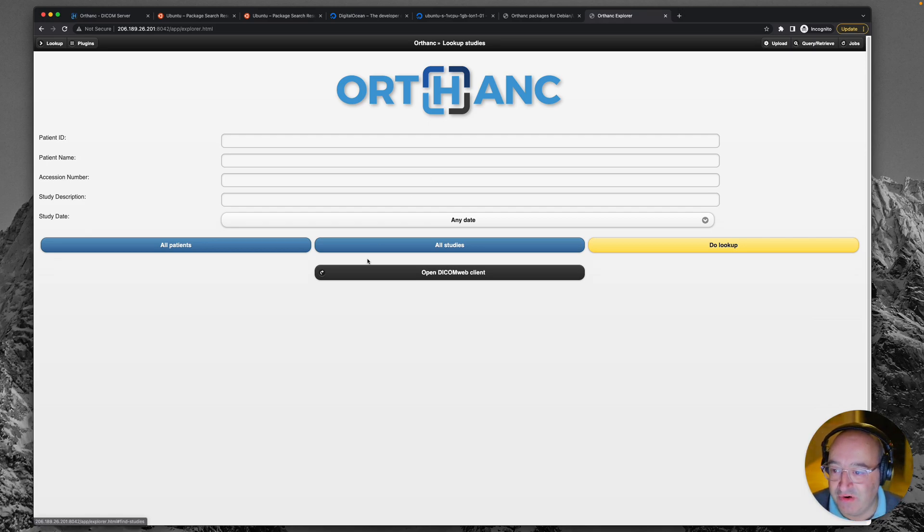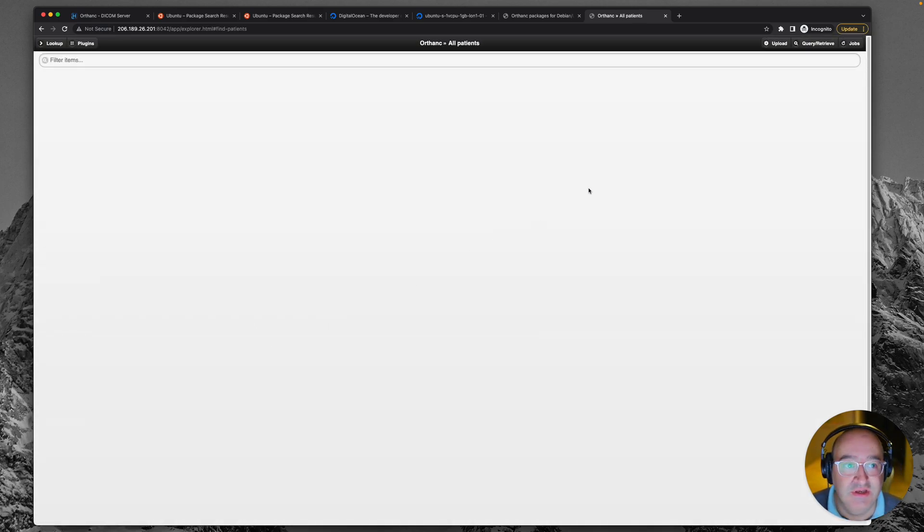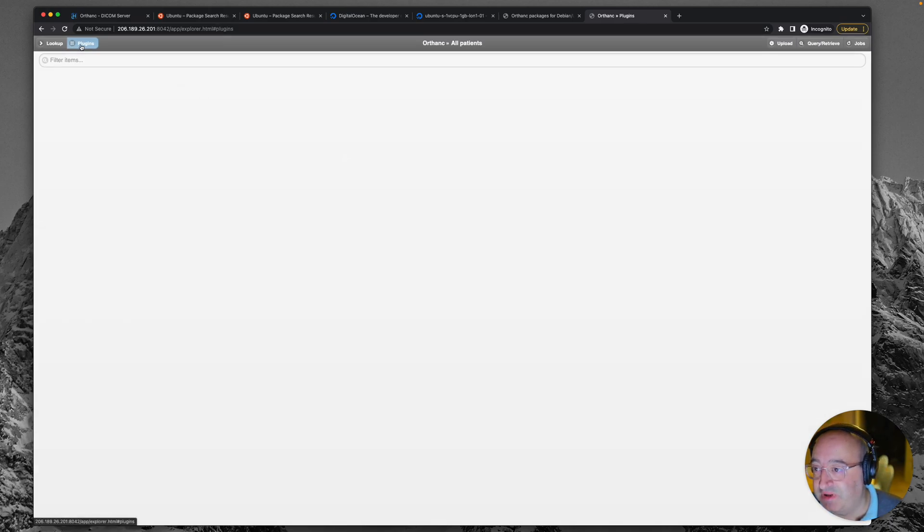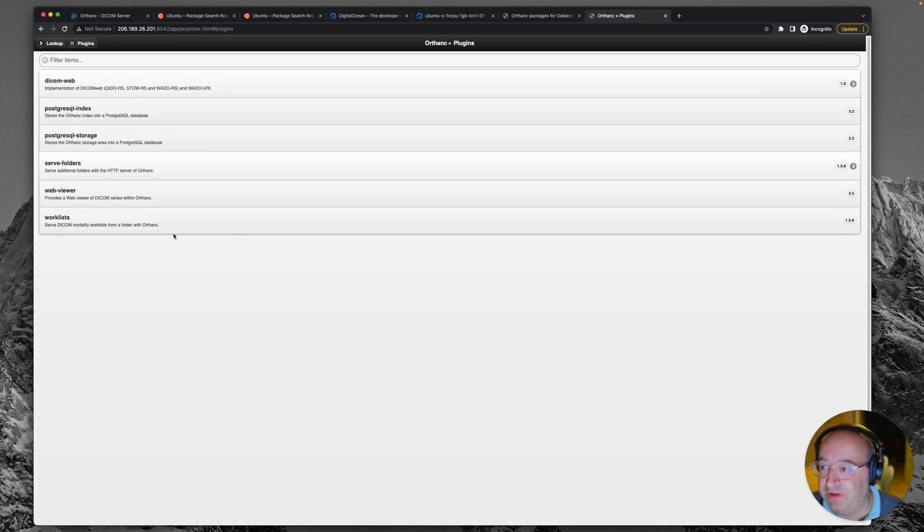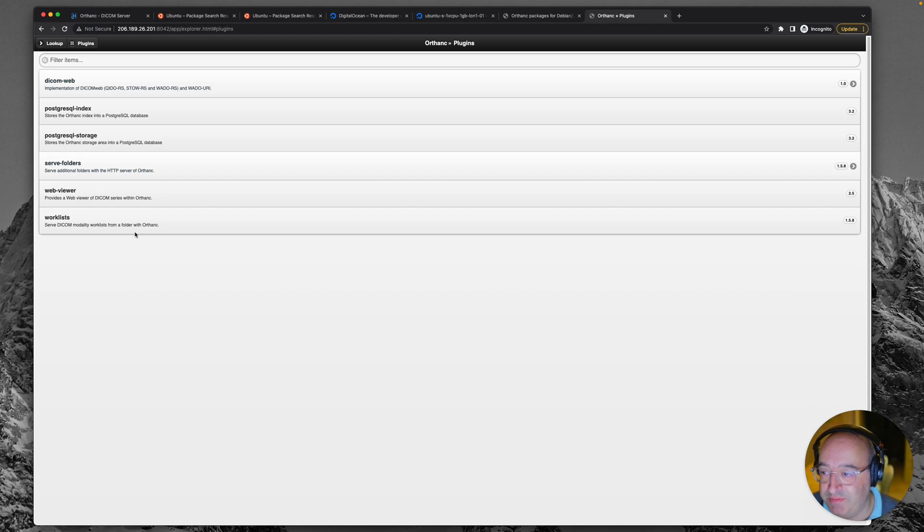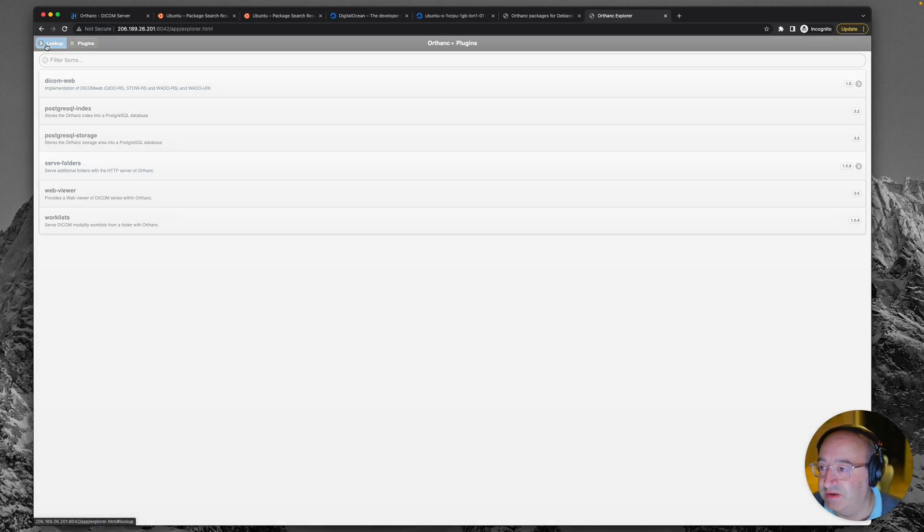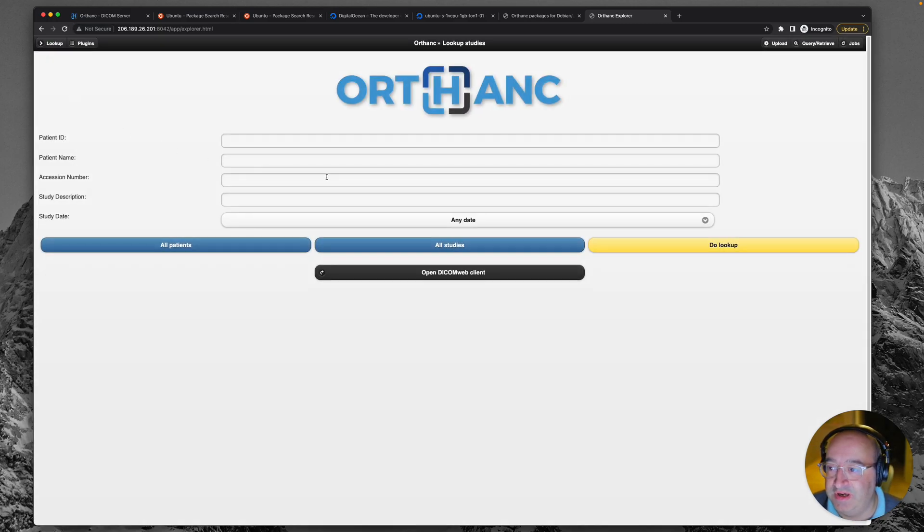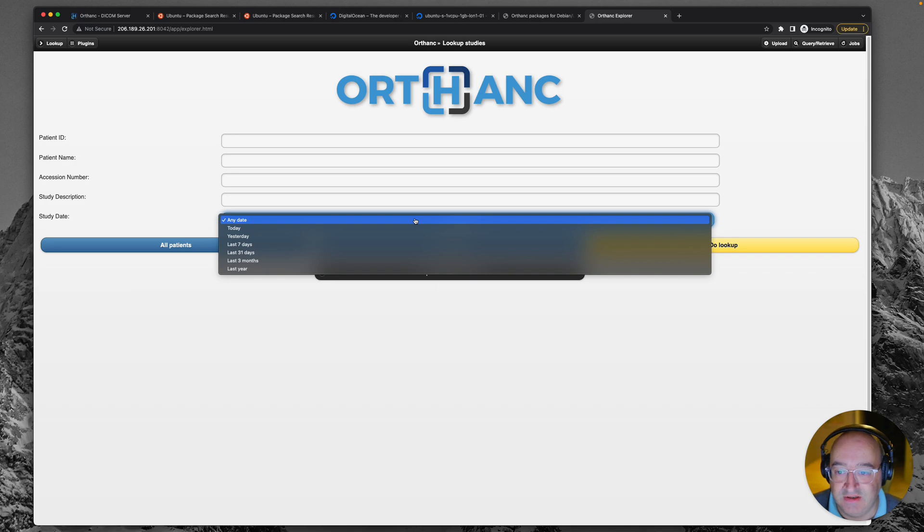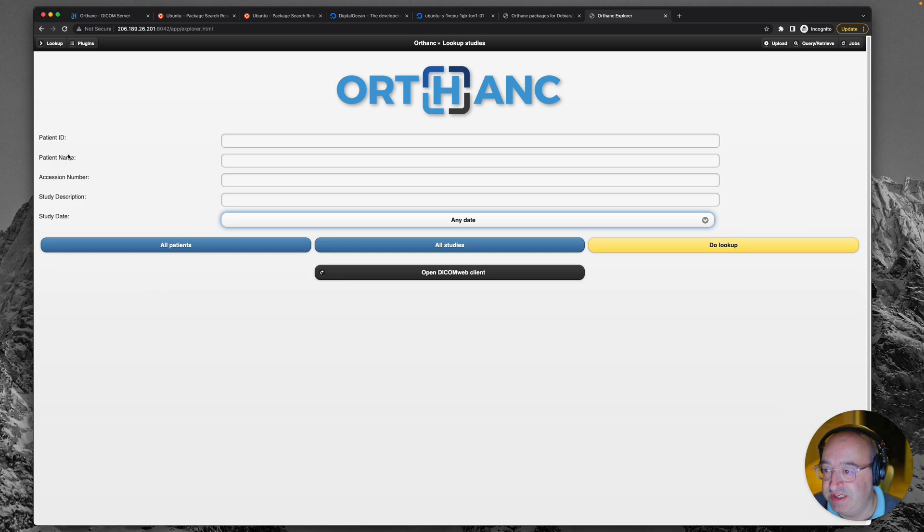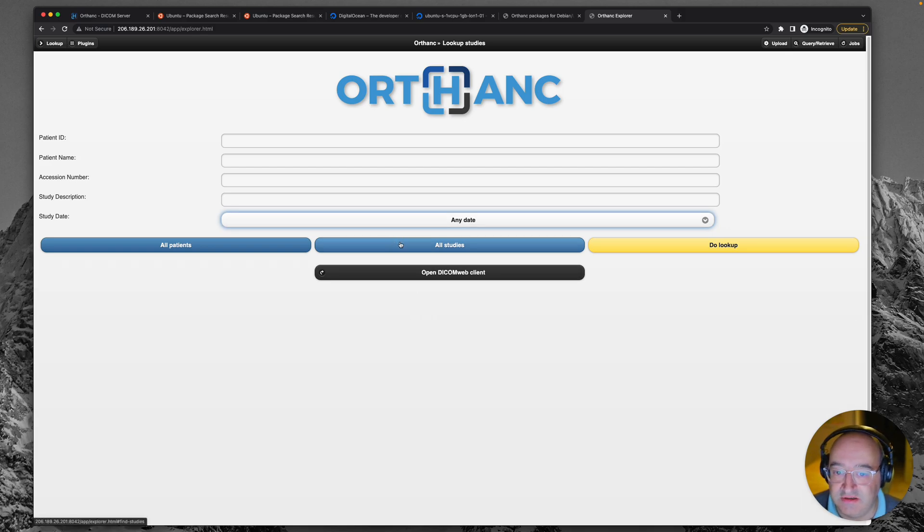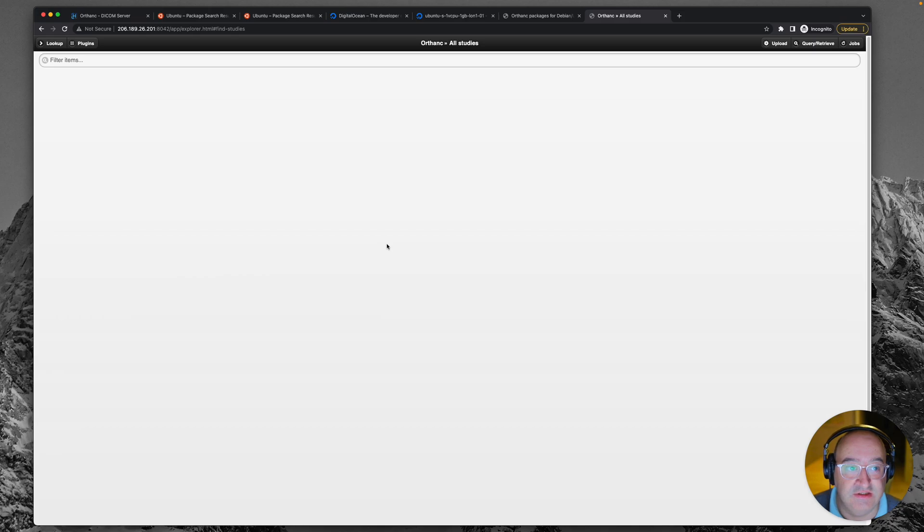So what can we do? We can have a look at all patients. And of course we've got none. We can see what plugins are installed. Now plugins are going to be those packages which you saw me installing when I did that long command where I pasted all the packages in. So you'll recognize some of those there. And we can click lookup and we get a search dialog. Yeah. Useful things like when they hit the packs, patient ID, name, accession number.